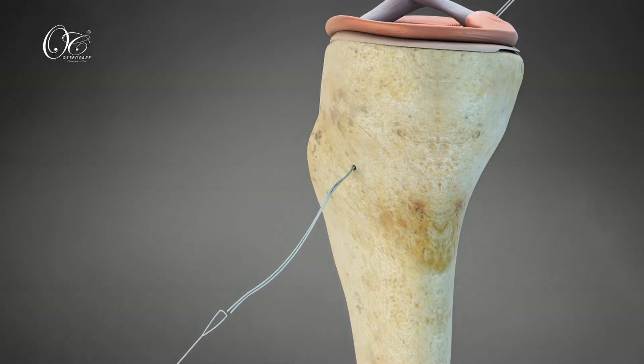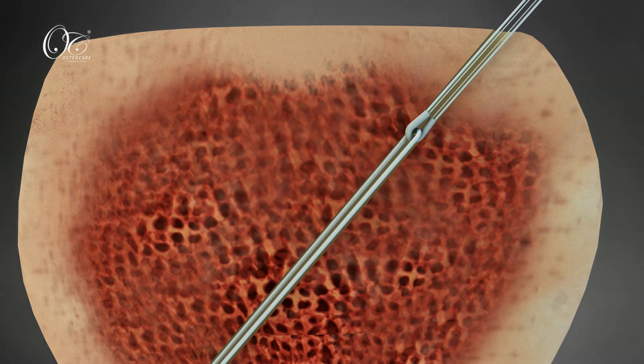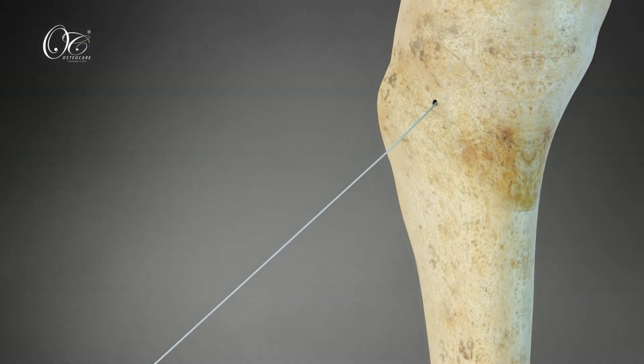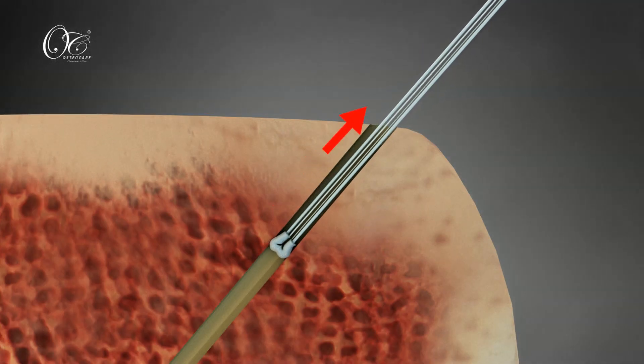Withdraw the introducer fiber from the accessory medial portal with the help of a loop and fiber. Anchor with the OsteoCare Root Fix Anchor in a retrograde manner. As the Root Fix Anchor is installed in the root at 3–4 mm, pull the strands to check pull-out strength.